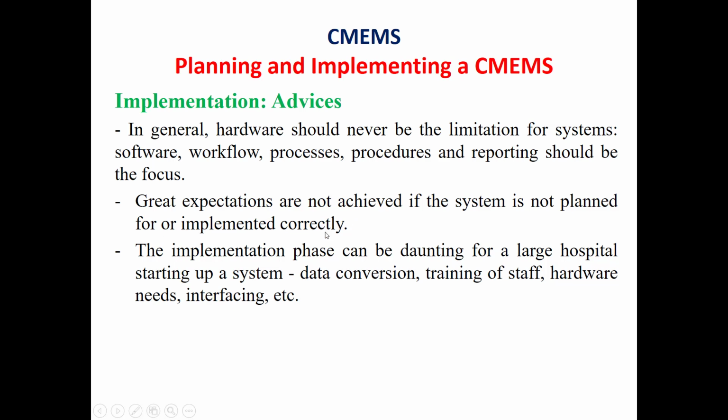Also, great expectations are not achieved if the system is not planned for or implemented correctly. Finally, the implementation phase can be daunting in case we have a large number of medical devices for a starting up system in a new hospital or medical system, for example data conversion, training of staff, hardware needs, interfacing, and so on. This will be very difficult and daunting for a large hospital starting up a system.